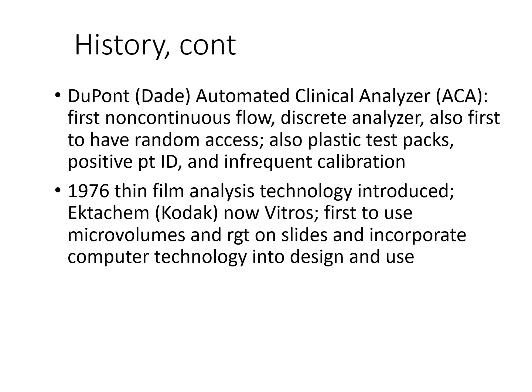Automated clinical analyzers. So the DuPont is the automated clinical analyzer option. Was the first non-continuous flow discrete analyzer. It was the first to have random access and introduced plastic test packs instead of glass. Positive patient identification options and required infrequent calibration.